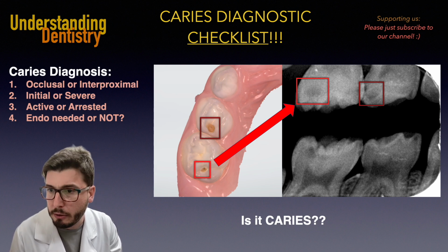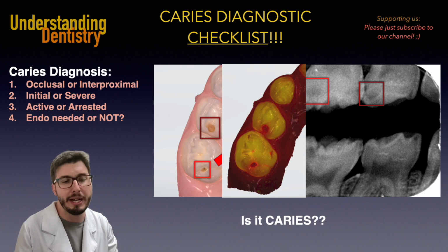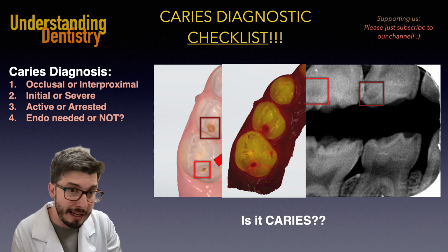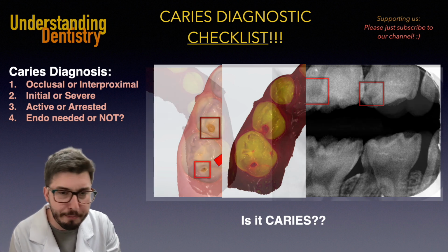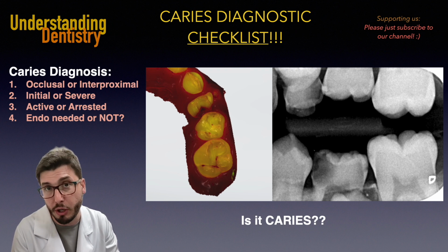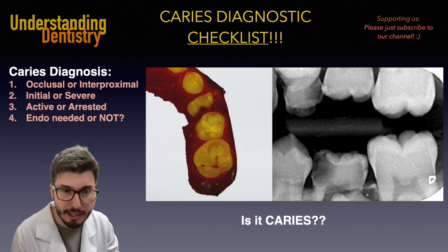permanent one. Let's see now other cases here, and even of course, the caries detection of the intraoral scanner. But again, we already confirmed it in the clinical examination, so that's just an additional tool you could use to show to the patient, because it's an image of diagnosis. So, all right, it's just additional data that you are using now. Although research can be finding new findings, of course, so it depends on when you are watching this video. Maybe we already have new results, new tools of fluorescence methods of intraoral scanners, right?